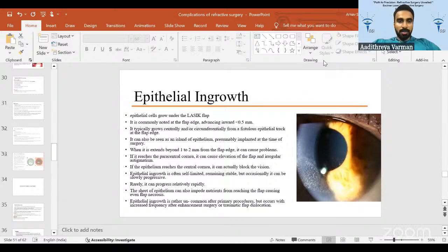Yeah, so that was very extensive, Dr. Arnav. That was very good. There's nothing much to cover beyond what you've said. You covered everything. There's one thing I wanted to discuss with the panel and Dr. Pooja, ma'am, in particular. One of the reasons why nowadays I'm not preferring SMILE for more than -7 or -8 spherical equivalent is that sometimes I see, a couple of months later, they come back with epithelial remodeling. The epithelium grows back to about 60, 70 microns, and they have a diopter or a diopter and a half of regression. It happens more with SMILE than LASIK. Any inputs on that, ma'am, and how to tackle this issue?